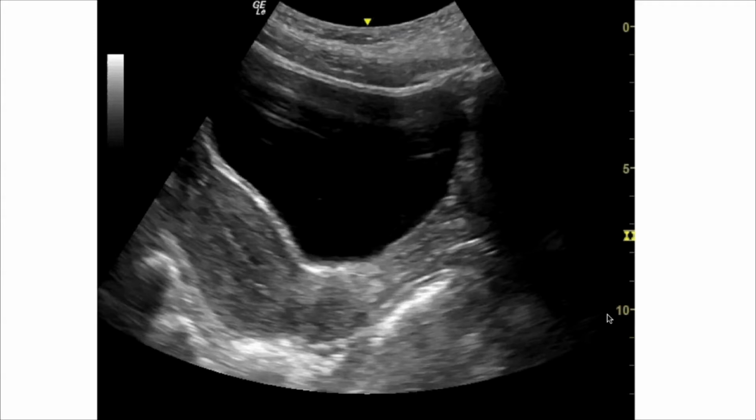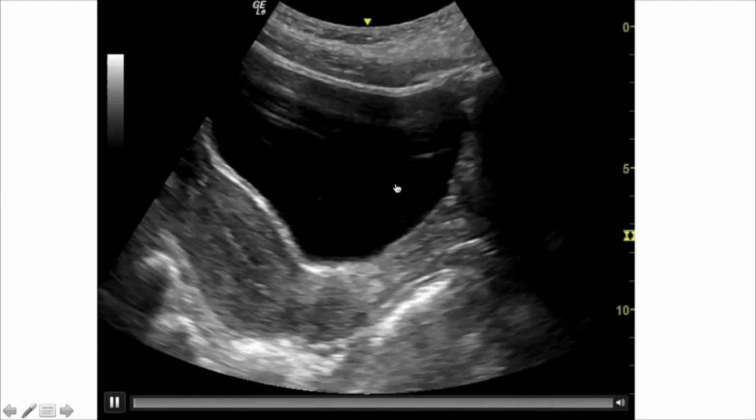The more difficult imaging occurs when you are trying to do an image with an individual standing, or if you're asking them to do an additional movement that requires more global musculature, just making sure that you maintain proper transducer position at all times so you have a very consistent measurement. And here again is our sagittal plane.